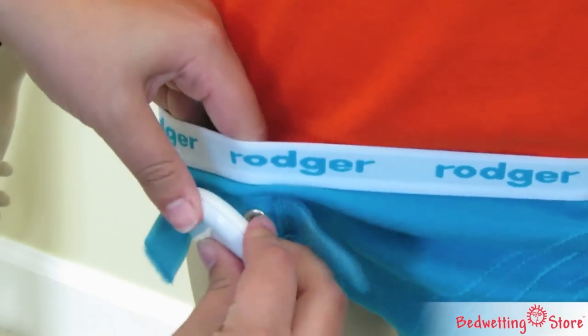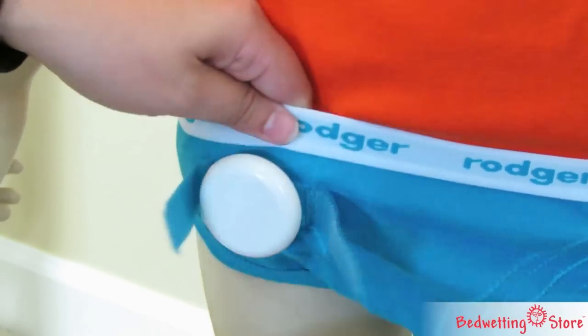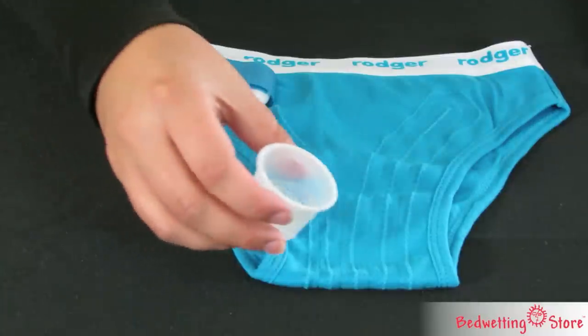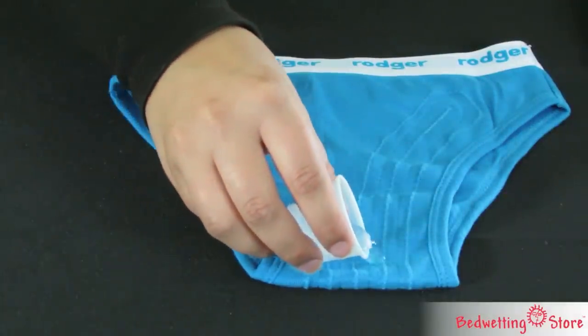The transmitter is snapped into a pair of Roger briefs which fit just like regular underwear. Moisture sensitive threads sewn into the briefs will trigger the alarm when wet, alerting both you and your child at the same time.